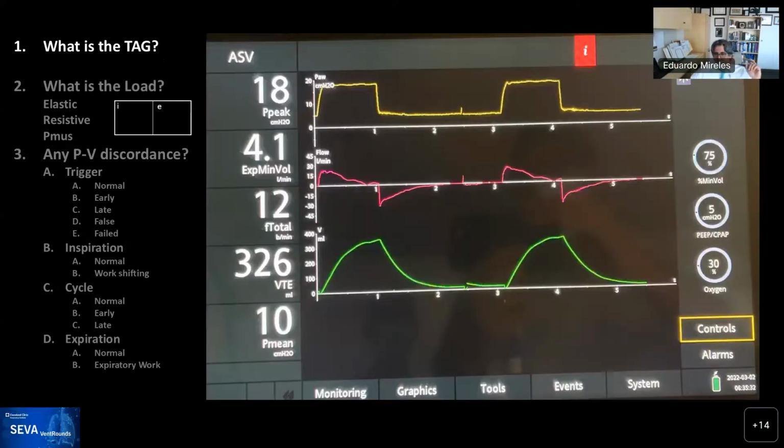And this is the last example. This is a good example of another mode that we have available. The mode name is up here. And what do you think the tag is?